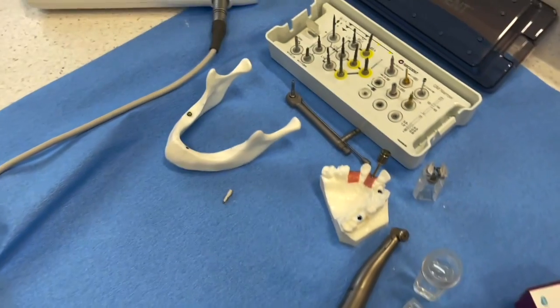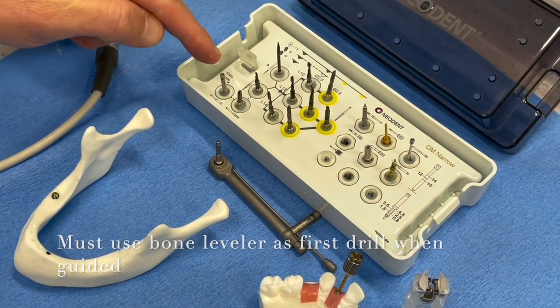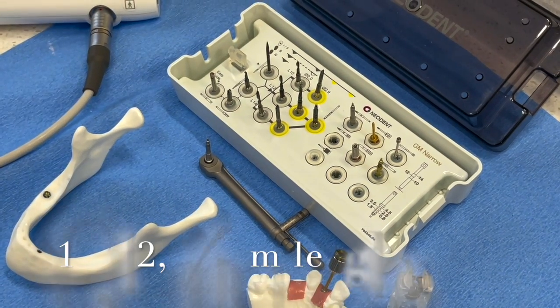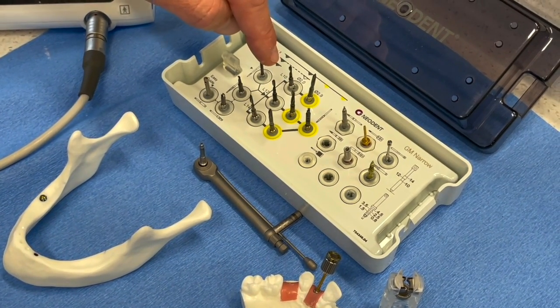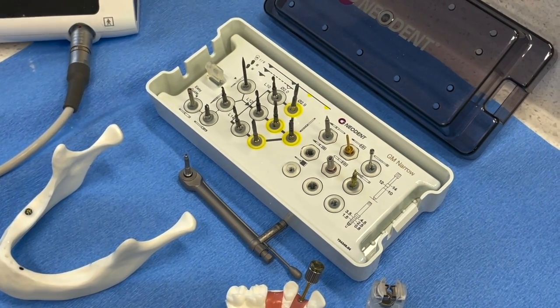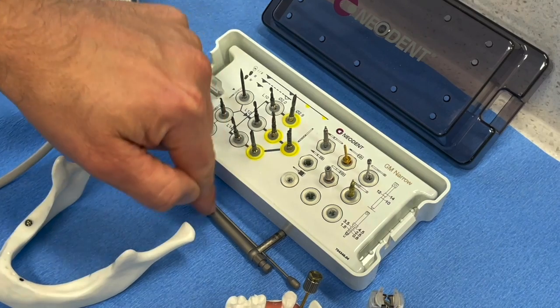Going into the kit from the bottom: you've got your tissue punch, bone gardener, and pilot drill. Steps one, two, three — moving toward the middle of the kit, we have 10, 12, or 14mm length implants in the 2.9 diameter. It's an easy guide-type guided system — 2.0 drill for softer bone, 2.9 for dense bone, and a counterbore or countersink to address cortical bone at the top.